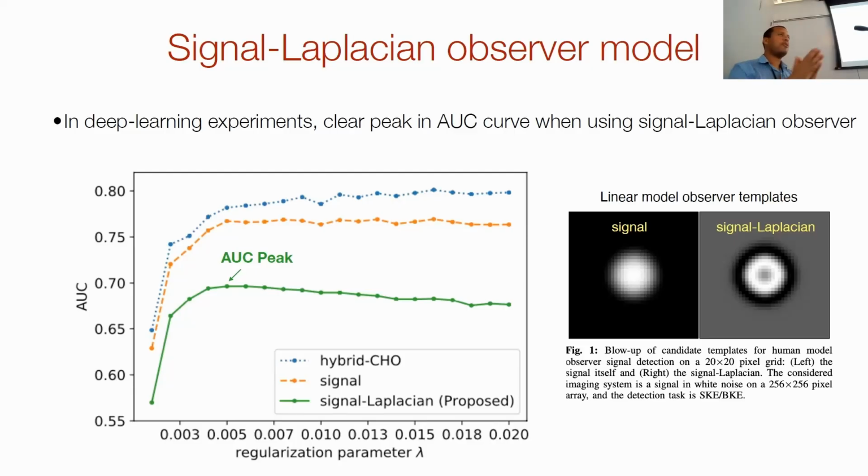That's exactly the situation I was thinking of when modeling detectability of a large signal, because when you look at a large signal, it's hard to pick it out from the middle of the signal. You're actually looking for the edge, right?